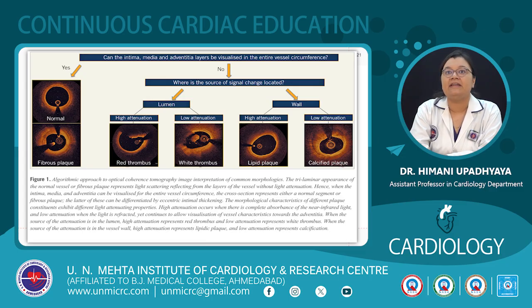Can the intima, media, and adventitial layers be visualized in the entire vessel circumference? If yes, then it is normal, or it can be a fibrous plaque. If there is a source of signal change, then where is it located? If it is located in the wall and has low attenuation, then it is a calcified plaque, which obviously has sharply demarcated borders. If it has high attenuation, it is likely to be a lipidic plaque. If there is a source of signal change in the lumen with high attenuation, there is likely red thrombus, and with low attenuation, then it is likely white thrombus.